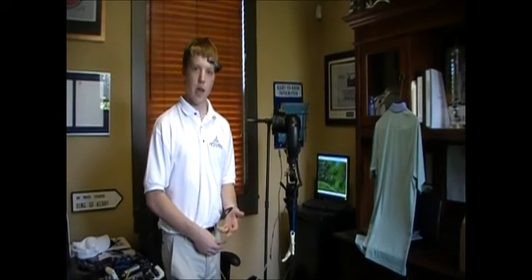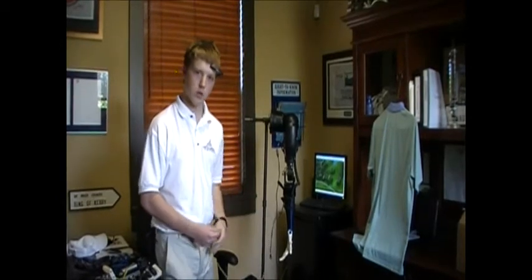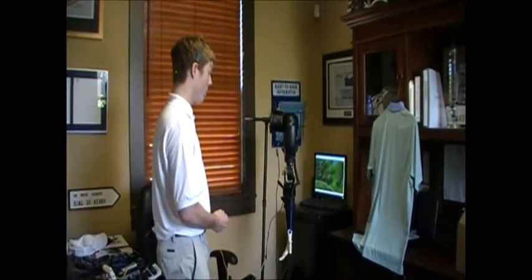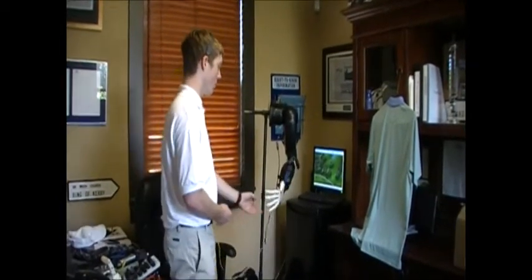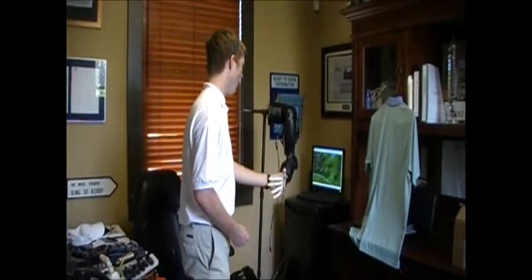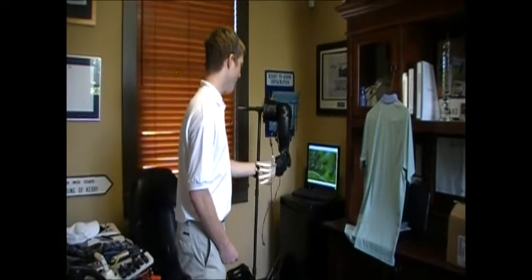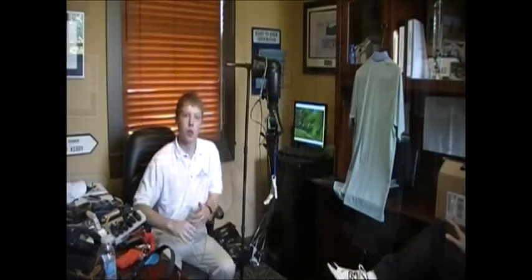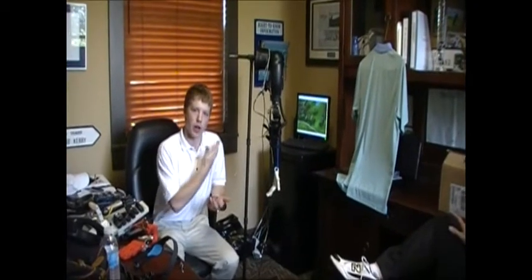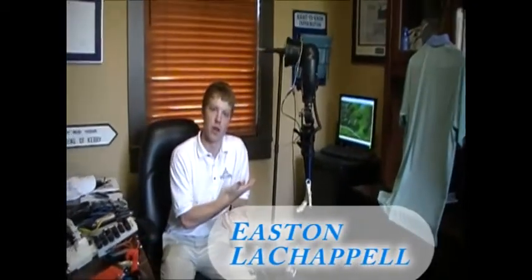It's interactive and you can actually use it for everyday use — it's a big part of prosthetics. This is just a start of what I have for the future. This is the second generation of the arm and I'm sure there are many more generations coming.